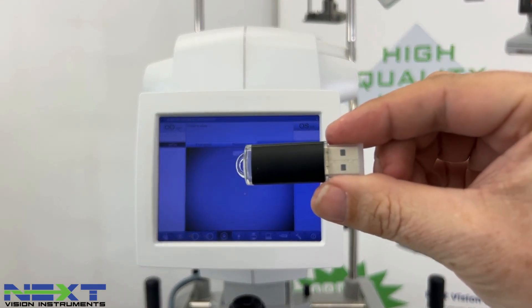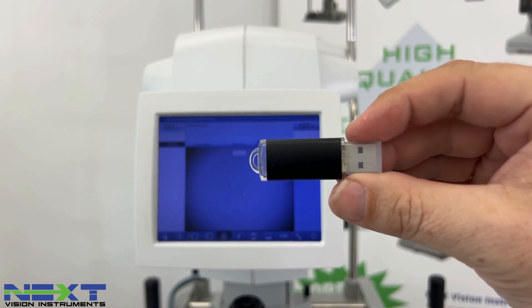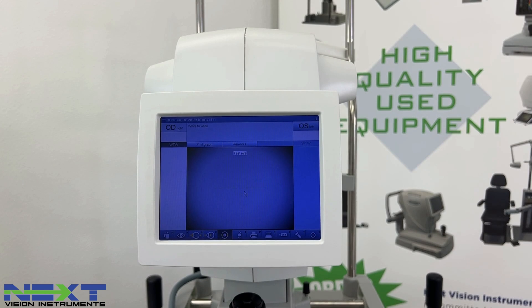If you have any questions on how to perform the calibration check or use the IOL Master 500 in general, the user's manual is on the included thumb drive. Plug it into your computer, pull it up, and go to the section that walks you through how to operate the instrument, check calibration, and overall usage.